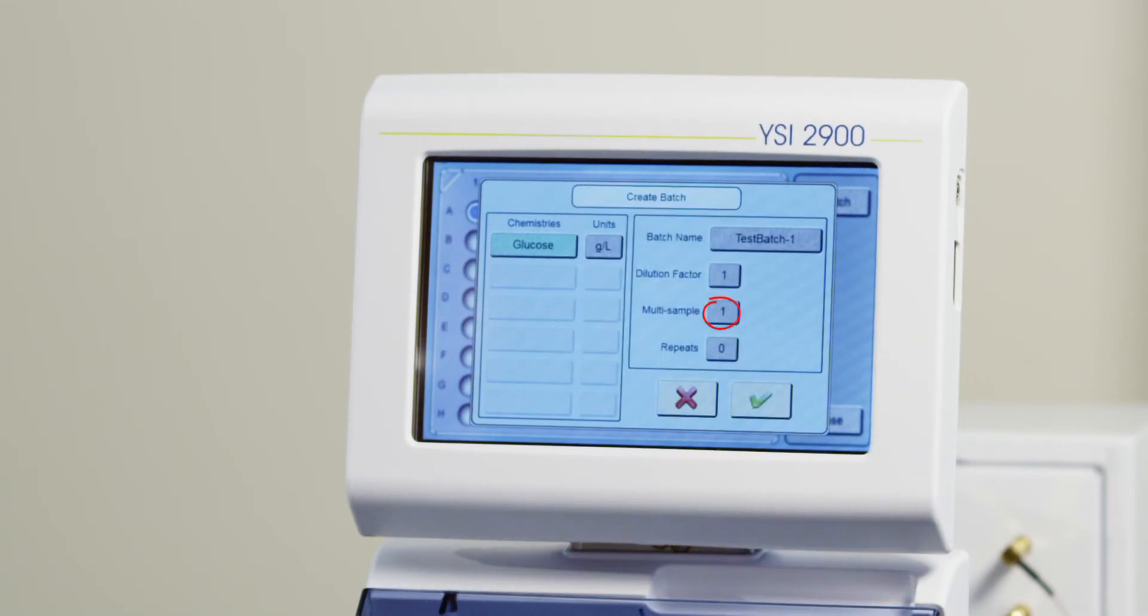The Multi-Sample option allows multiples of each sample to be run. For example, if the Multi-Sample is 2, each sample will be sampled and run twice in a row. If the Repeat button is set to 1, the entire batch will be repeated.